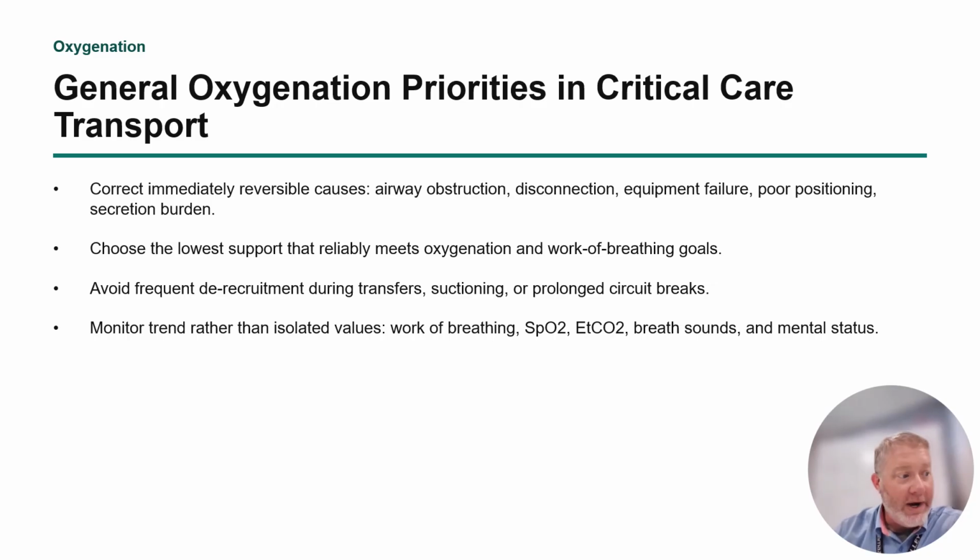Finally, you want to monitor trends, not just single numbers, but watch for the work of breathing, watch the SpO2 as it migrates up and down, watch the end-tidal CO2 as it migrates up and down or stays down. Frequently check their breath sounds to make sure there's no change within their internal process. And then also, importantly, their mental status over time. Level of consciousness is imperative with regards to oxygenation.